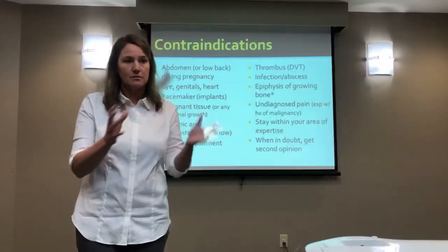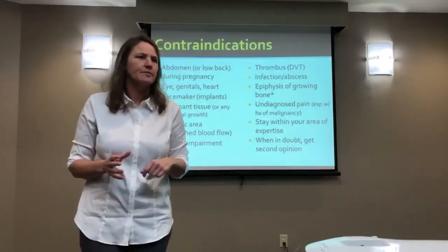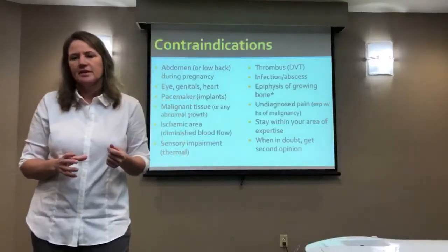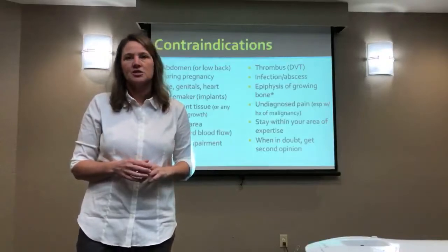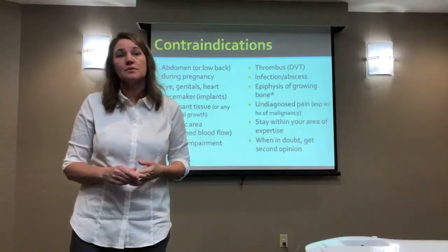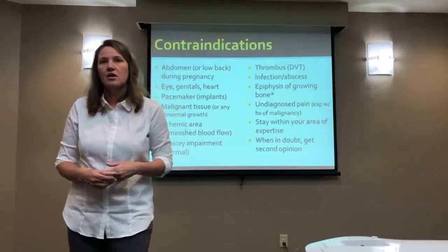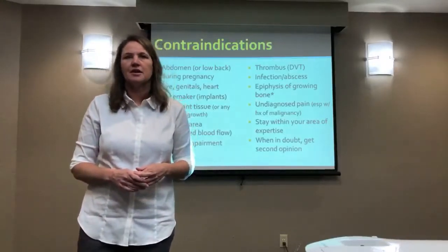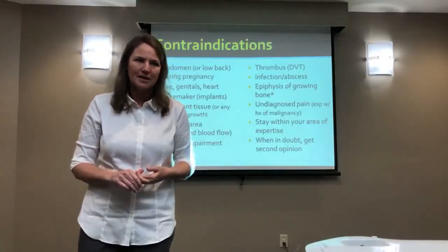As of recent, that's the most common one that I've seen that was well proven. But there's definitely some out there, and I'll pull them out and we'll talk about it. Maybe I'll pull a couple up today because I've got some on my computer, just to talk about the results. And I do think probably a lot of treatments that are done out there are not effective. I think the majority of ultrasound treatments, if the therapist is not thinking about the target, not thinking about why they're doing it, I'm not sure they're getting any benefit.